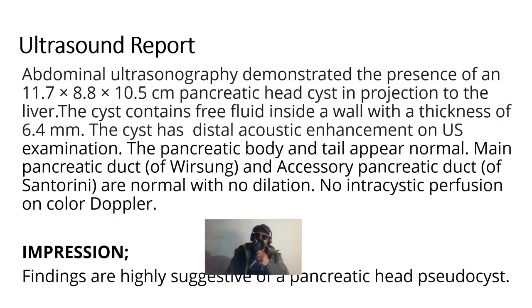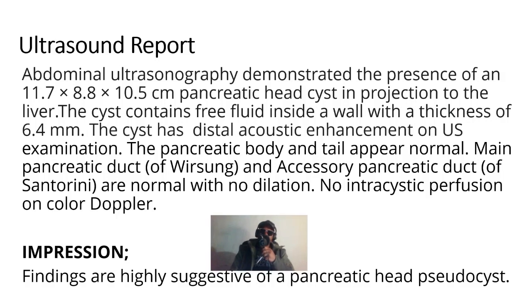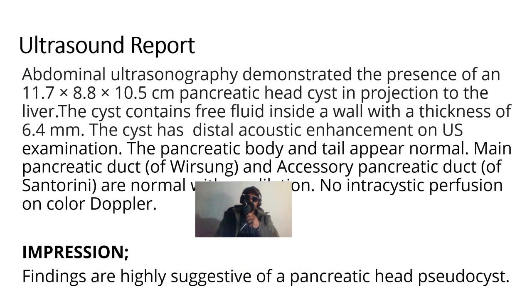I need us to understand how you report on different pathologies. So below, I am going to give you a sample report on how you report on such a case. This is a sample ultrasound report for this case that we have here.